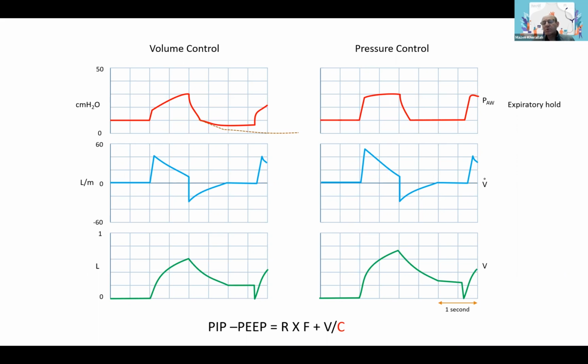At that time, you need to look at ventilation and oxygenation, and you need to minimize the pressure. So whether you use pressure control or volume control, the aim is to utilize the minimum pressure possible and the minimum volume possible that will allow the lungs to heal and close that air leak while you're ventilating the patient.